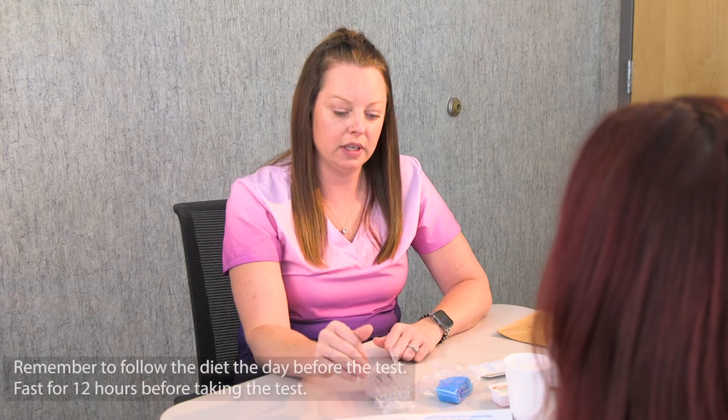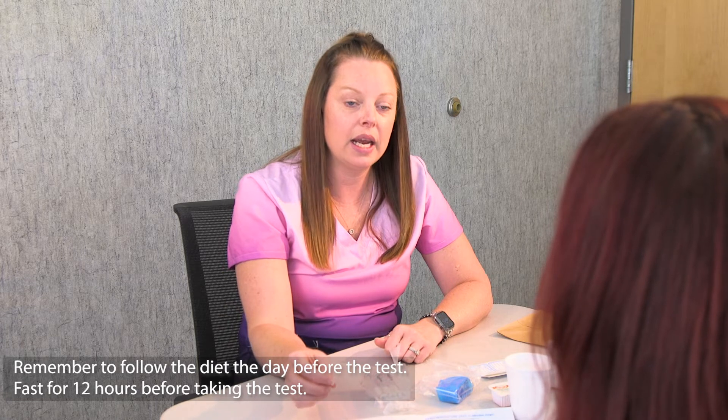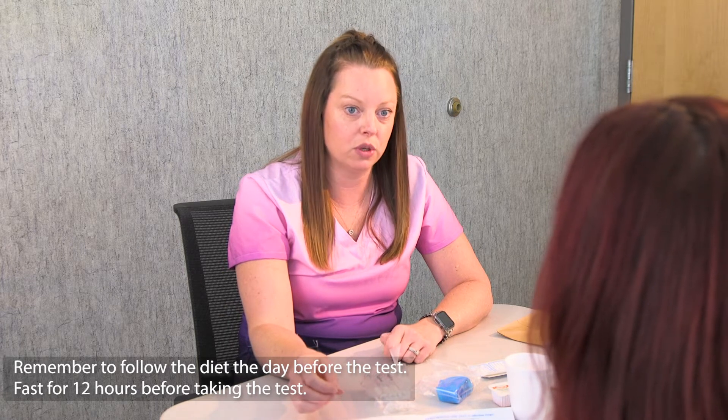Before you start any of this, make sure you follow the diet the day before the test and then fast for 12 hours before doing the test.